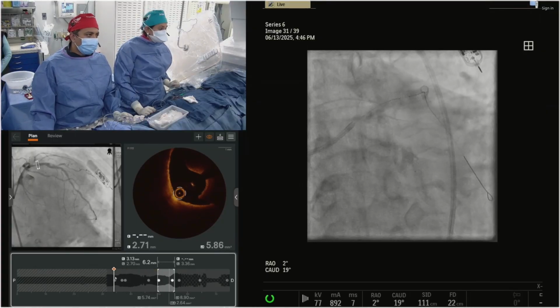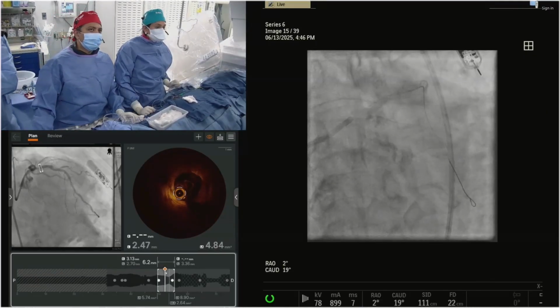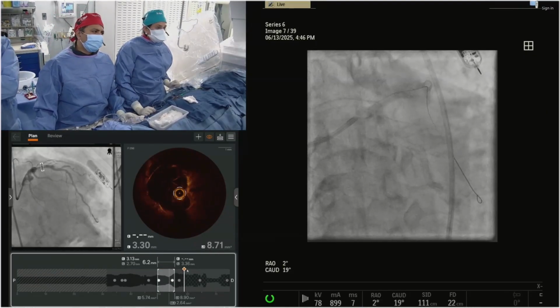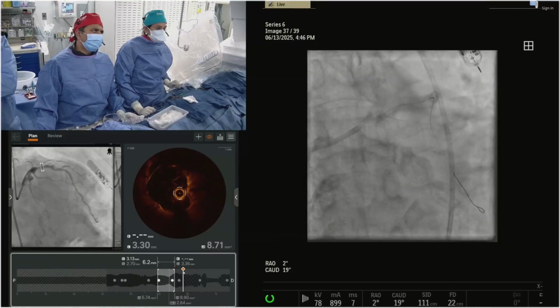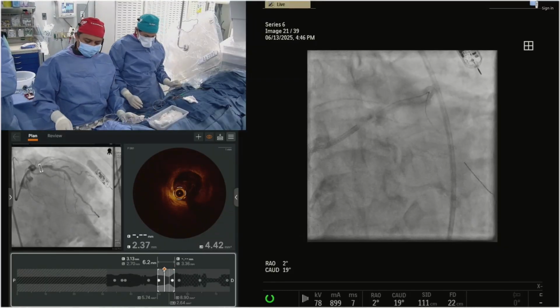In our lab, we would say, get the IVUS. Yeah, that's what I was going to say. Take the IVUS, that's a good one. Or just take a non-compliant balloon, go up, see if it expands. If it doesn't, then do Shockwave. Shockwave doesn't care whether it's superficial or deep, so that's always an option.